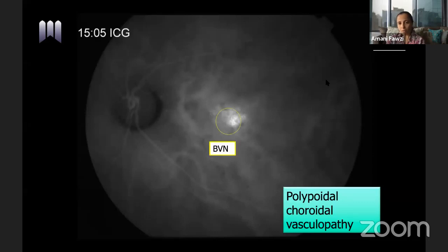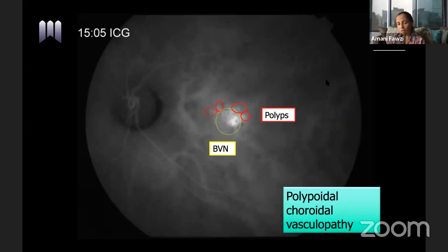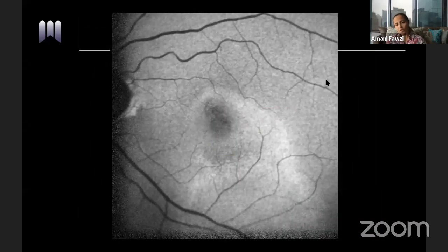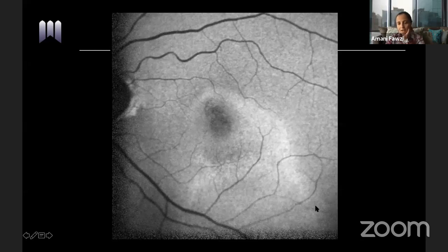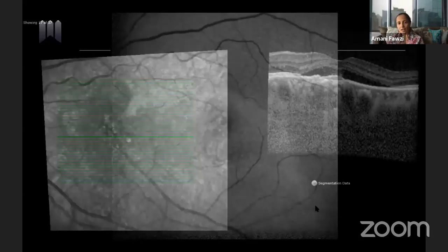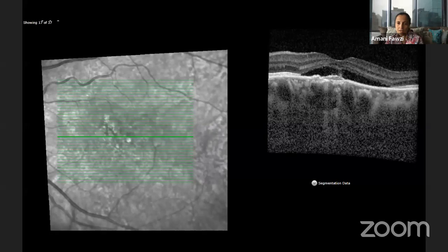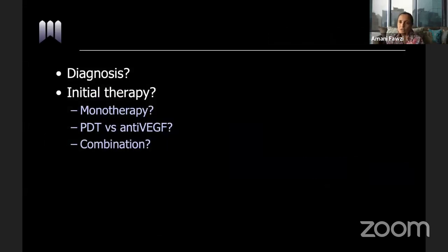In the United States, when we suspect polypoidal, we get ICG. On the ICG you can see the branching vascular network giving a diffuse plaque-like appearance, and on the borders you see tiny round polyps — the markers of polypoidal choroidal vasculopathy. The autofluorescence gives a clue that maybe this patient had CSR in the past, as they start out with central serous retinopathy and then over time the RPE gets irritated and develops neovascular degeneration. The trickling fluid pattern suggests prior CSR, which is why we asked about steroids.